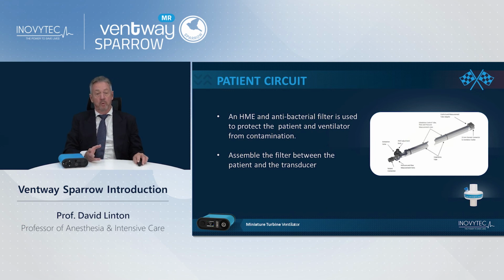And we use all kinds of filters, but it must be an HME and antibacterial.